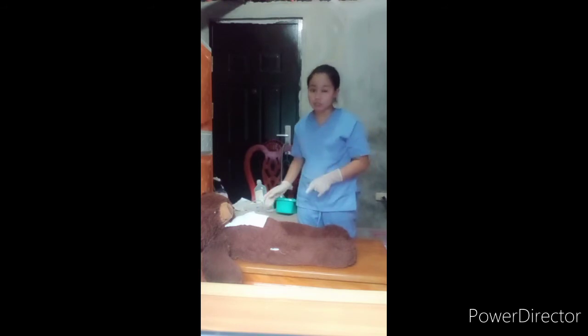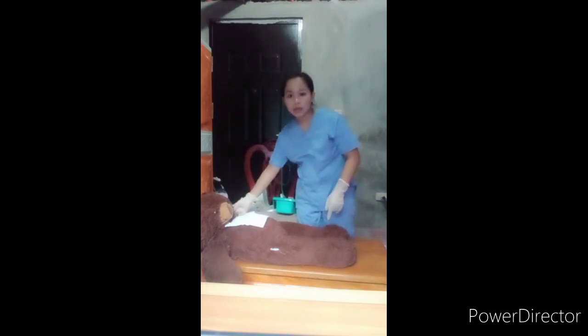So pre-oxygenate the patient appropriately before suctioning. And then next, let's open a swivel adapter or remove the delivery device if the patient was receiving a mechanical ventilator. And next is, let's advise the patient that suctioning will begin. Insert the catheter without applying suction until resistance is met or the patient coughs, then pull back.